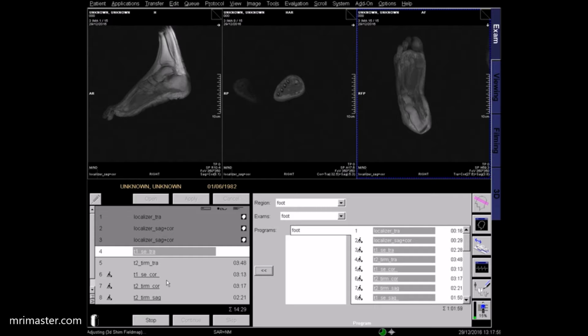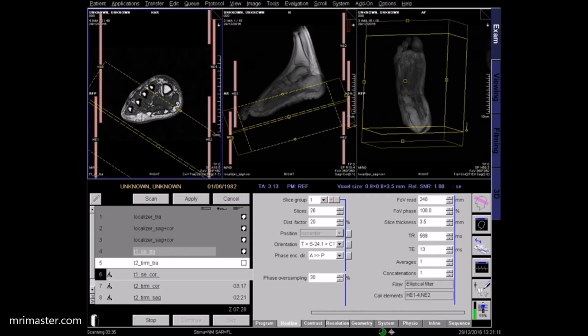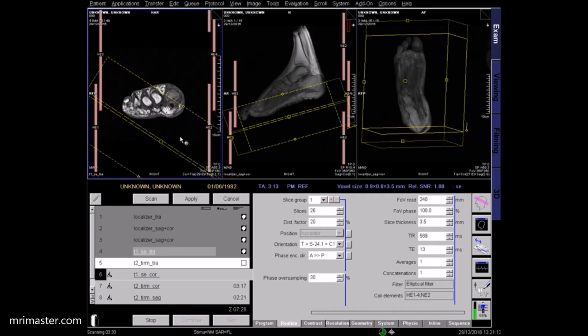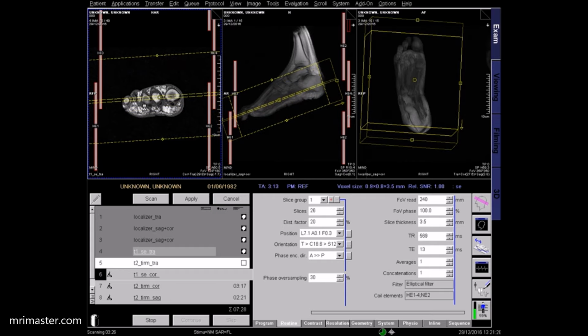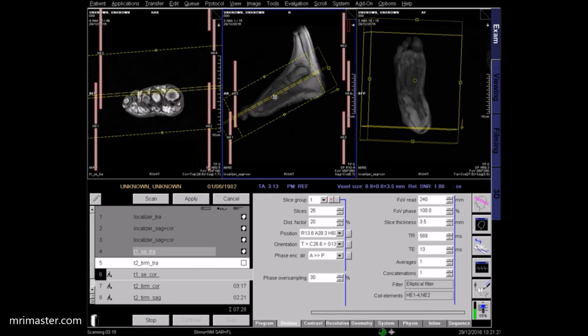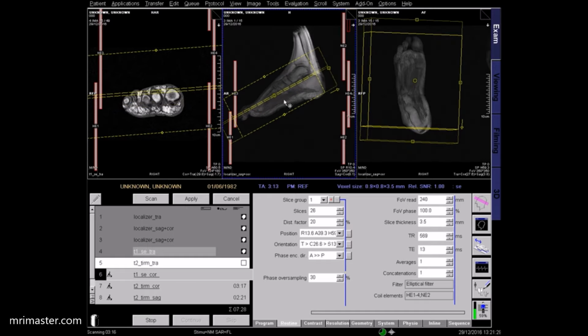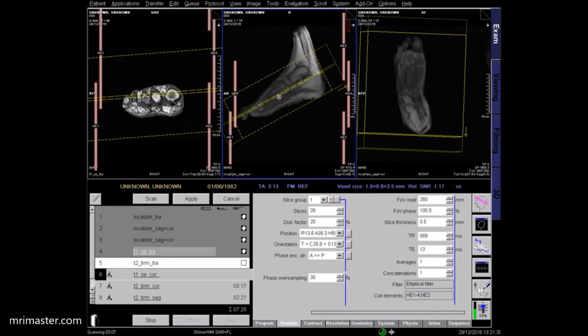Now plan a coronal T1 sequence using the acquired axial T1 images. Align the planning block straight across the metatarsal bones. On the sagittal localizer, the coronal slices should be parallel to the long axis of the metatarsals. Make sure to cover from the dorsal to the plantar aspect of the foot. To include the whole foot, you may have to increase your field of view, depending on the pathology and the size of the foot.